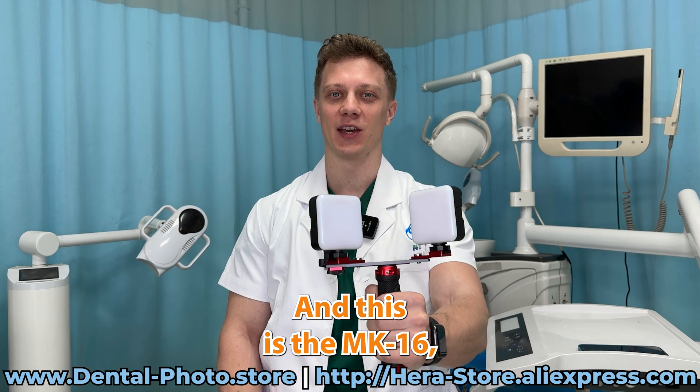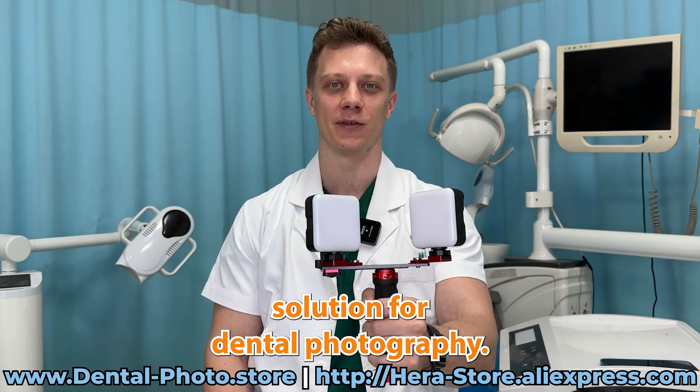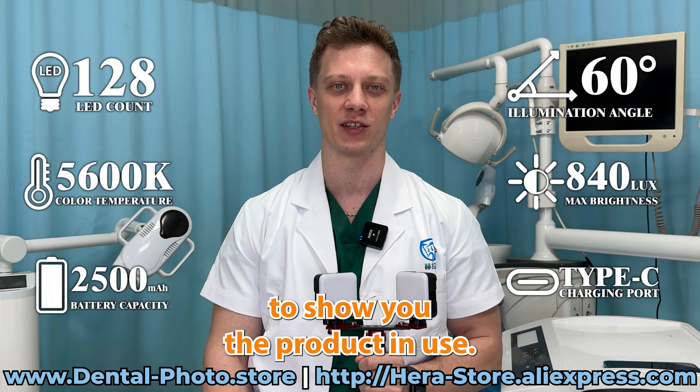Hi, it's Nick and this is the MK16, the most powerful and the most popular solution for dental photography. You can check out the detail specs on the product page and I'm going to show you the product in use.